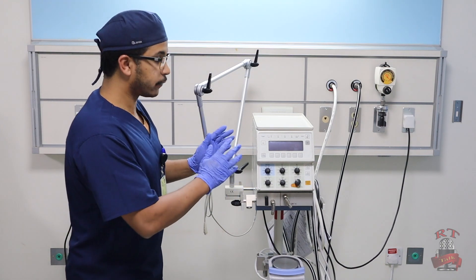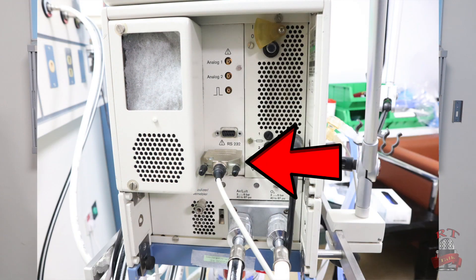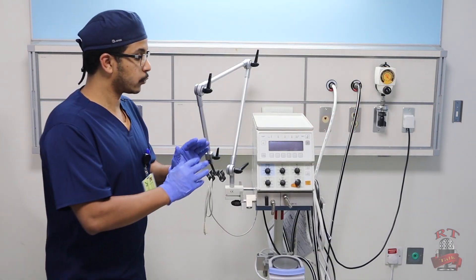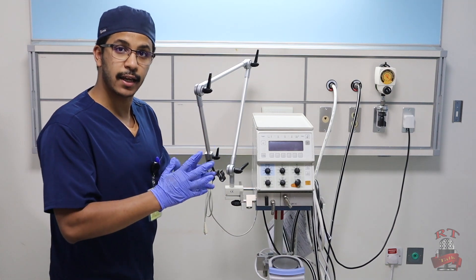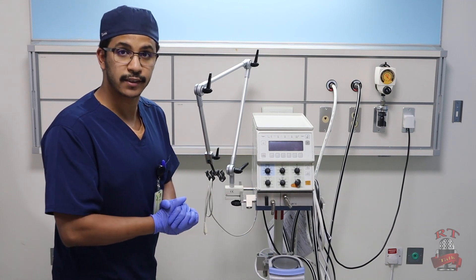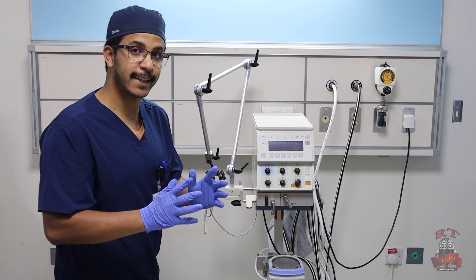After this, you will find in the back — as you see in the picture — the cable for the flow sensor. So you will make sure that you connect also your cable for the flow sensor. Now after we connect the oxygen line, the medical air, the electricity for the ventilator and for the humidifier, and our flow sensor cable, we will show you how to connect the ventilator circuit.